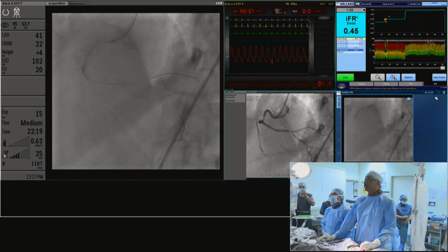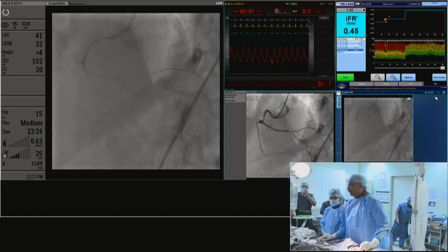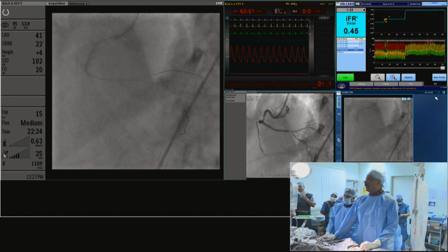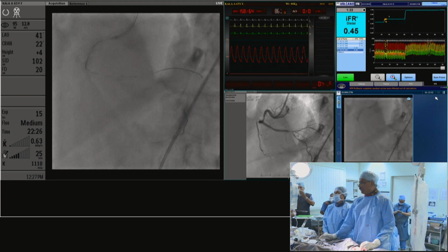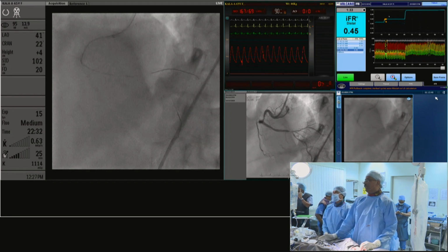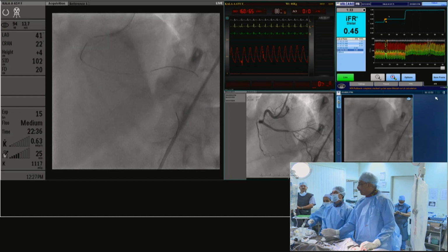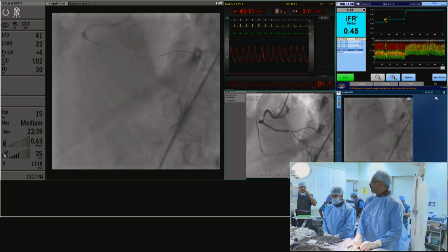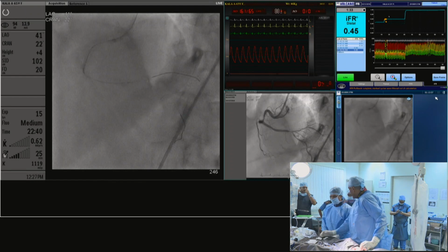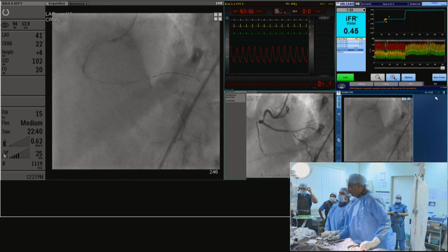After all, we've got to do a good job on the proximal as well as the distal. So this is what I'm going to do next. We're going to get a 3.0 balloon. So I did it sequentially, 2.5 non-compliant, 2.5 angiosculpt, and now a 3.0. Prep the whole area down, and then see how the balloon moves up and down, and only then open the stent, because I'm not in a hurry to put a stent in before we prep it. So 3.0 balloon, please.